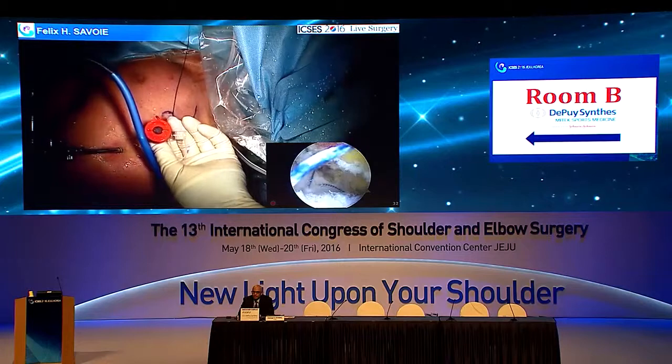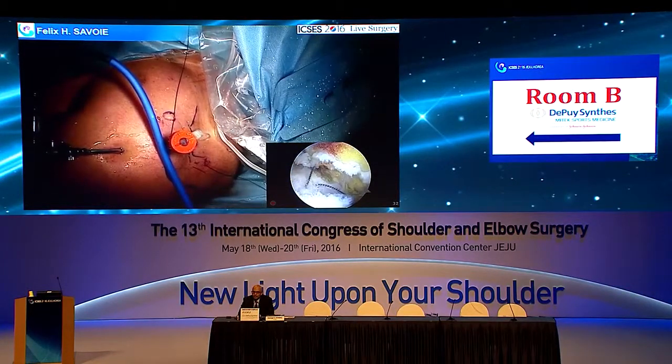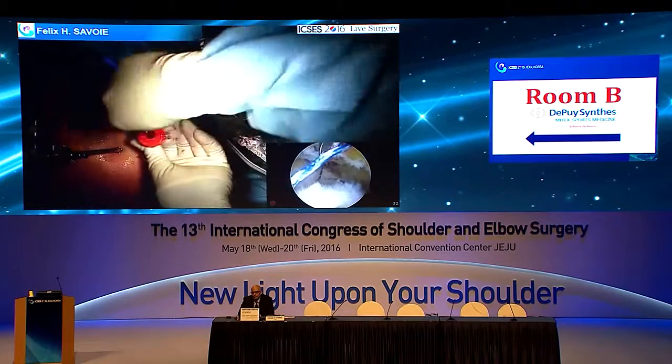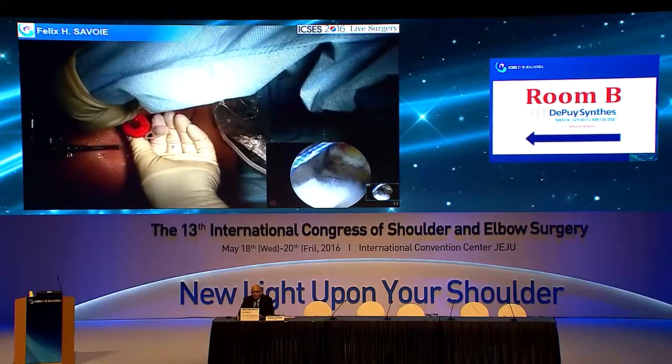Those are a little close. See that? I made a mistake. Uh-oh. Okay. Let's have the other grasper. No. The magic grasper. Lobster claw. Perfect. Yeah, no worries. I dropped it. It's completely my fault. But see how these are a little close together? These should have been further apart.